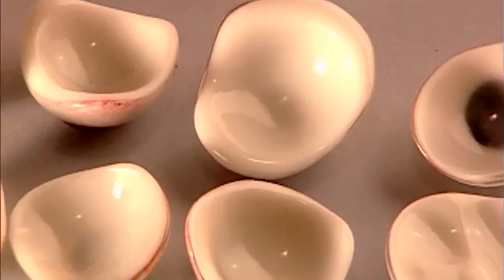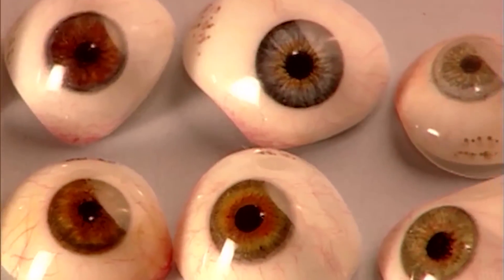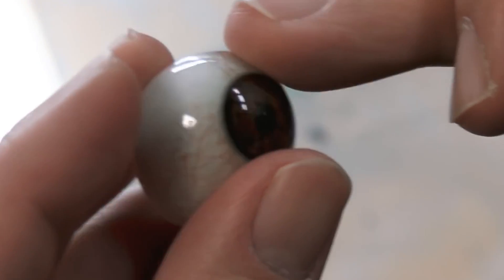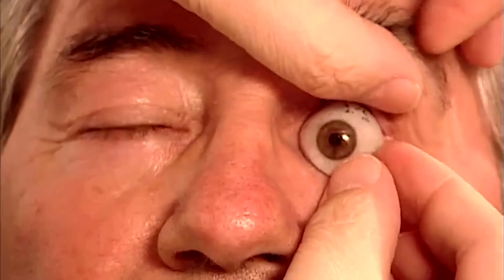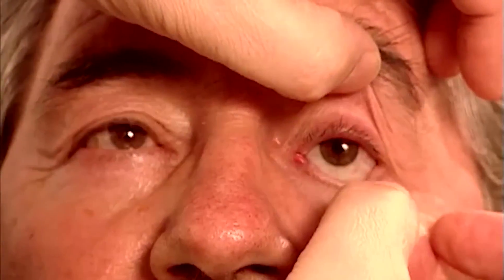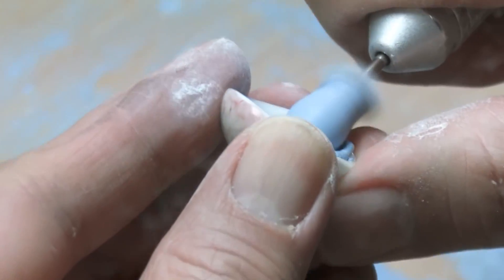The expected lifespan of an artificial eye is around six years, as long as it is looked after properly. Once polished and finished, the artificial eye is fitted into the patient's eye socket. The ocularist carefully inserts the prosthetic eye and makes any necessary adjustments to ensure a comfortable and secure fit, which may involve trimming the edges or making minor modifications to improve alignment.